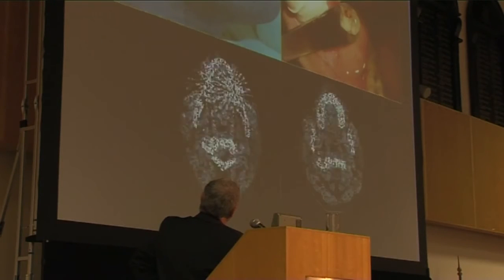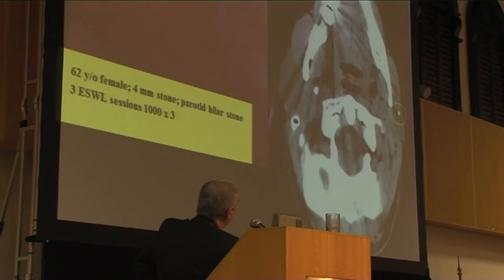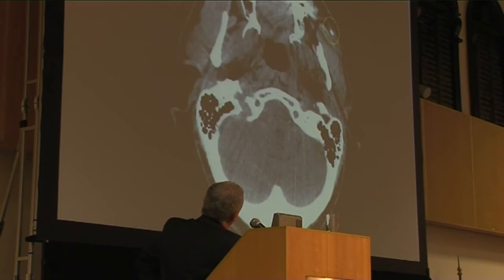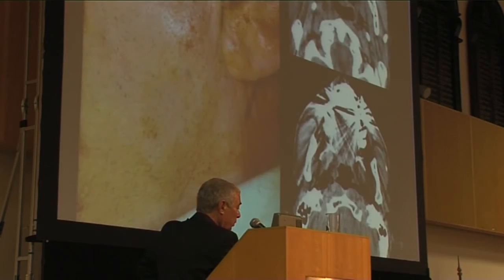And in this case, this patient was sent to us after a failed attempt to remove the stone by endoscopic surgery. And this is after the first session, second session, and after the third session, the stone located very near to the orifice. In this case, the stone located in the hilum, and after a session, it moved to the middle part, and with very easy endoscopy, you remove the stone.